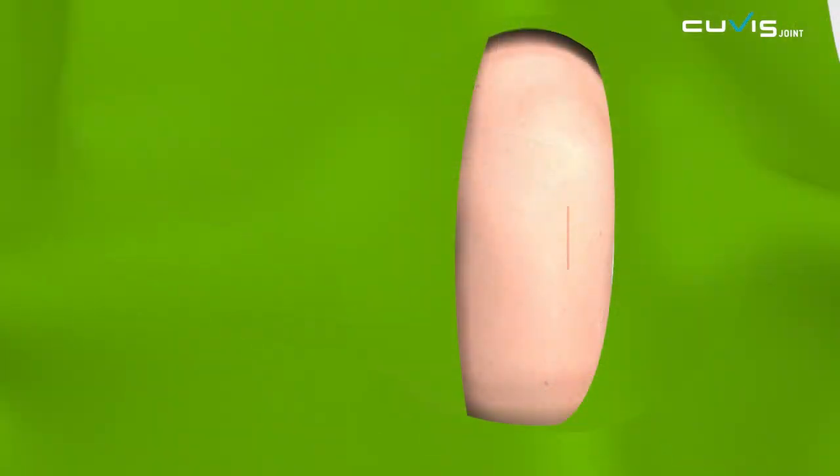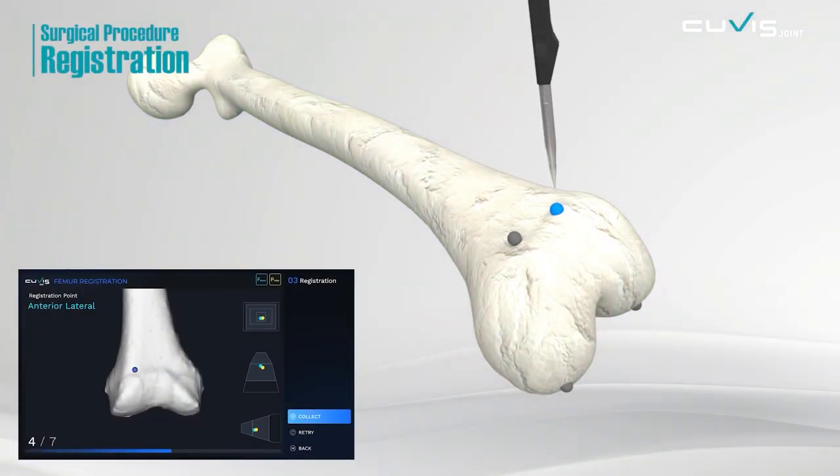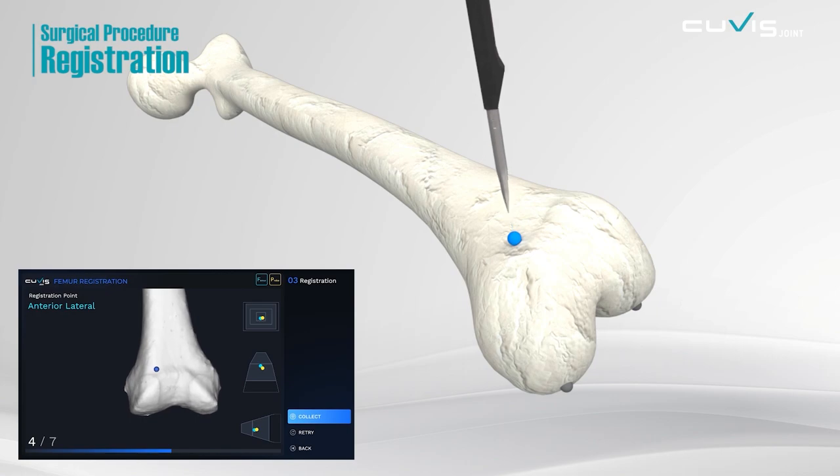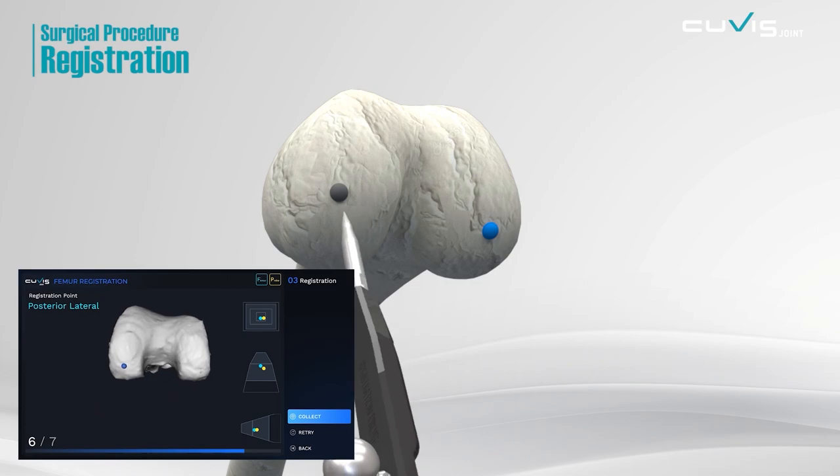Robot preparation is needed prior to surgery. Once it is done, the user will proceed with the incision. Register the actual patient's data by clicking some points on specific surface areas of the femur and tibia, following the direction of the main console.